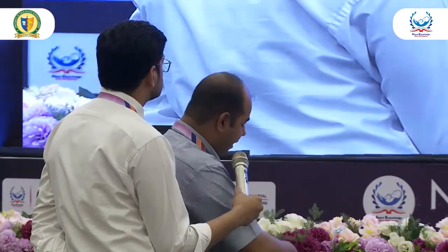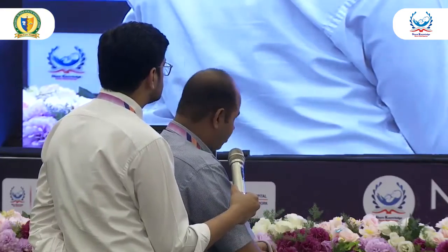उसमें एक aspect जो बहुत ज़्यादा लोगों को confuse करता है कि when we place a probe cover तो हम gel कैसे लगाएंगे. For that you can use simple saline during the procedure or even you can use pyodine as well. Biopsy कर रहे हैं कोई और है, हम pyodine भी use कर सकते हैं या simple 10 cc syringe में saline place करके अपने पास रखिए और जब कभी आपको लगे कि आपका field dry हो रहा है, you can just spill a few mLs of saline over the field और आपको दोबारा सब कुछ नजर आ रहा होगा.